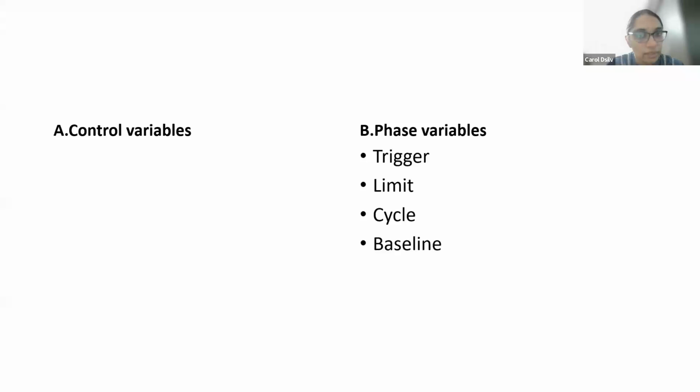When they show you a ventilator graphic, it could be either to identify the modes or to identify some abnormality. Most of you would have learned modes by pattern recognition, right? You'd say, if it's square shaped, it's probably volume control, but that's not the idea. What you should observe is what your control variables are. Is it a pressure controller or a volume controller? Volume or flow controller is the same. If it's a pressure controller, you'll see a constant pressure throughout inspiration. And if it's a flow controller, you'll see a constant flow, it'll never be a constant volume. Remember, volume is nothing but the inspiratory flow into the inspiratory time.